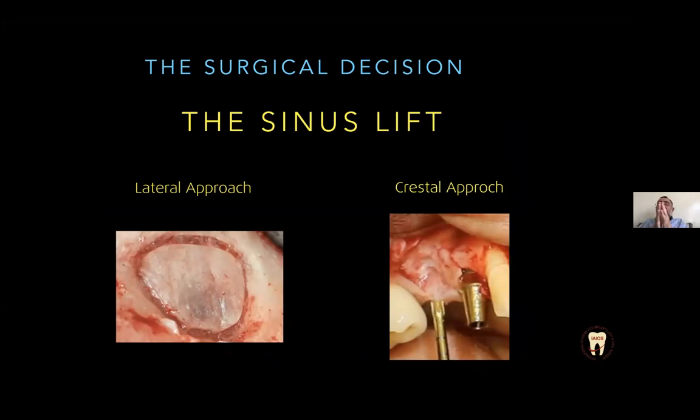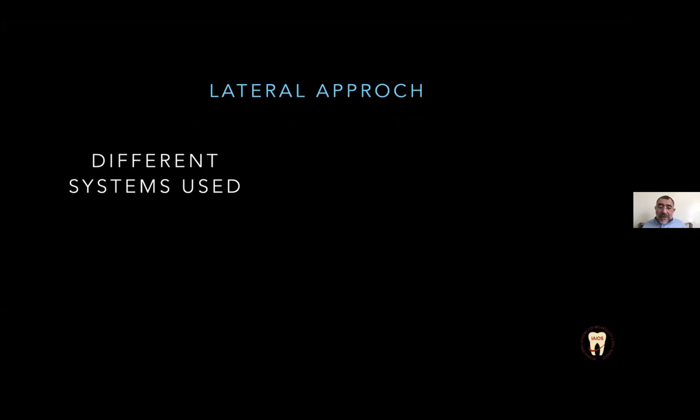Now we are in front of our patient. We study our CBCT, and we want to perform surgery in our sinus, and we have to do a sinus lifting. Which approach do you have to use to get a good result? In sinus lifting, we have especially two techniques: a lateral approach or a crestal approach. As you know, the lateral approach has been used for 30 years. I have used this technique for 25 years.